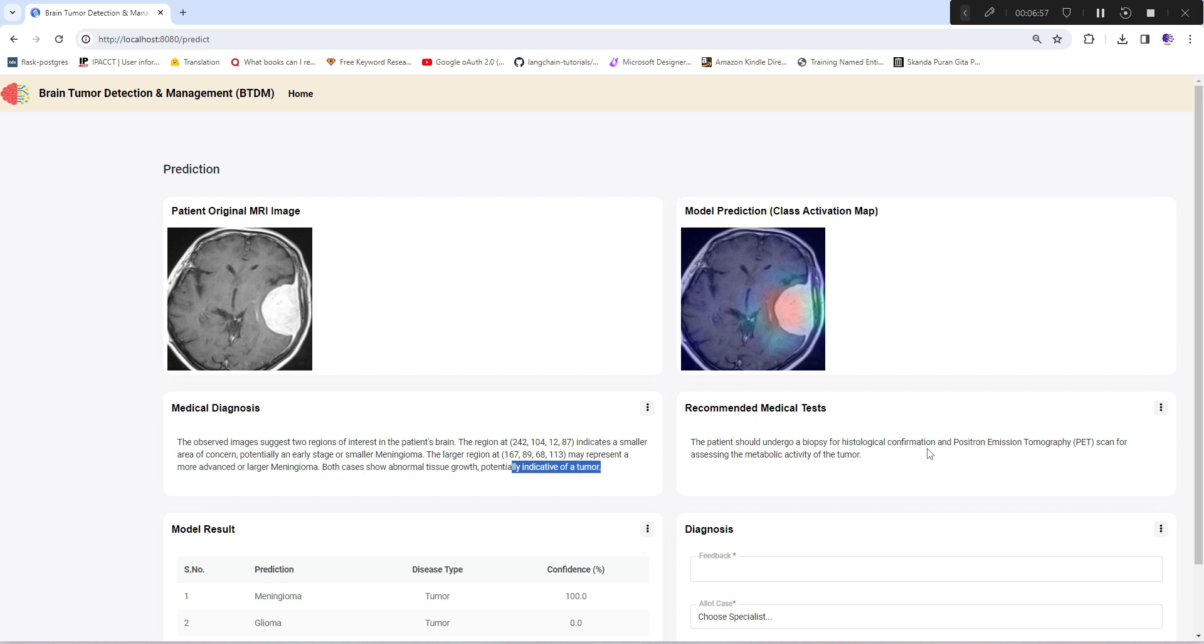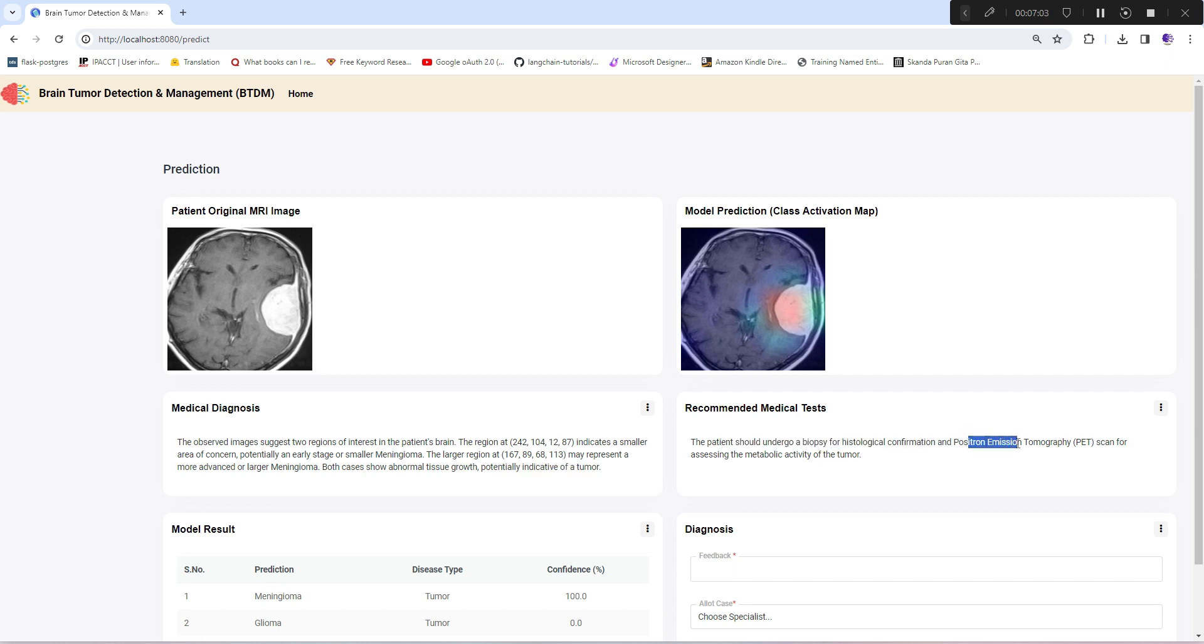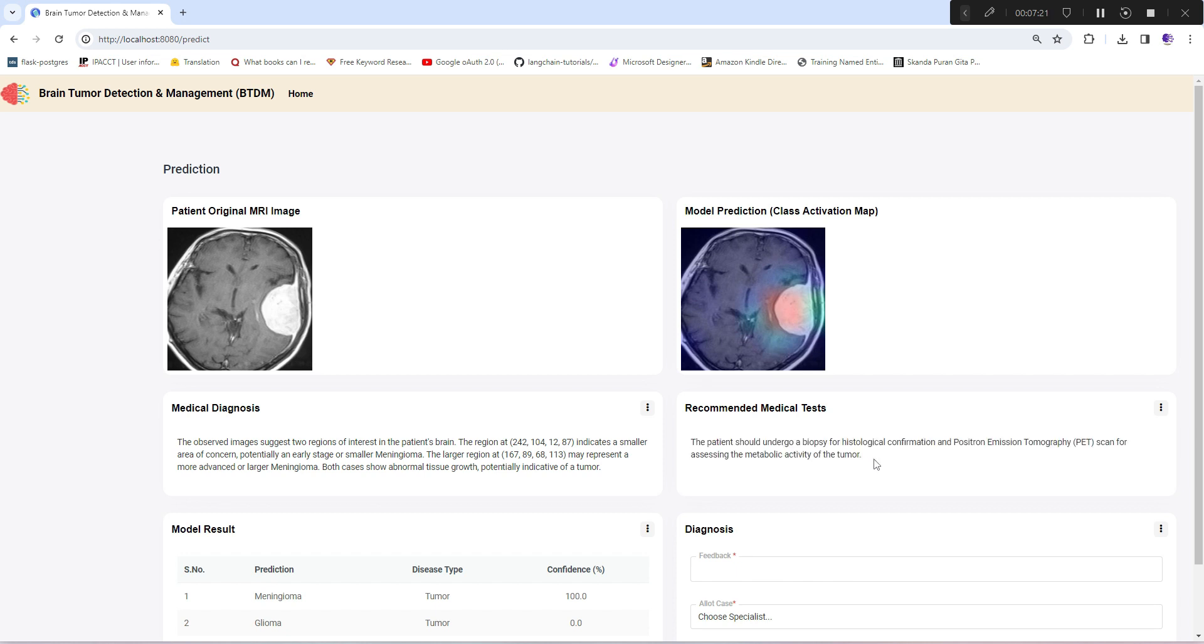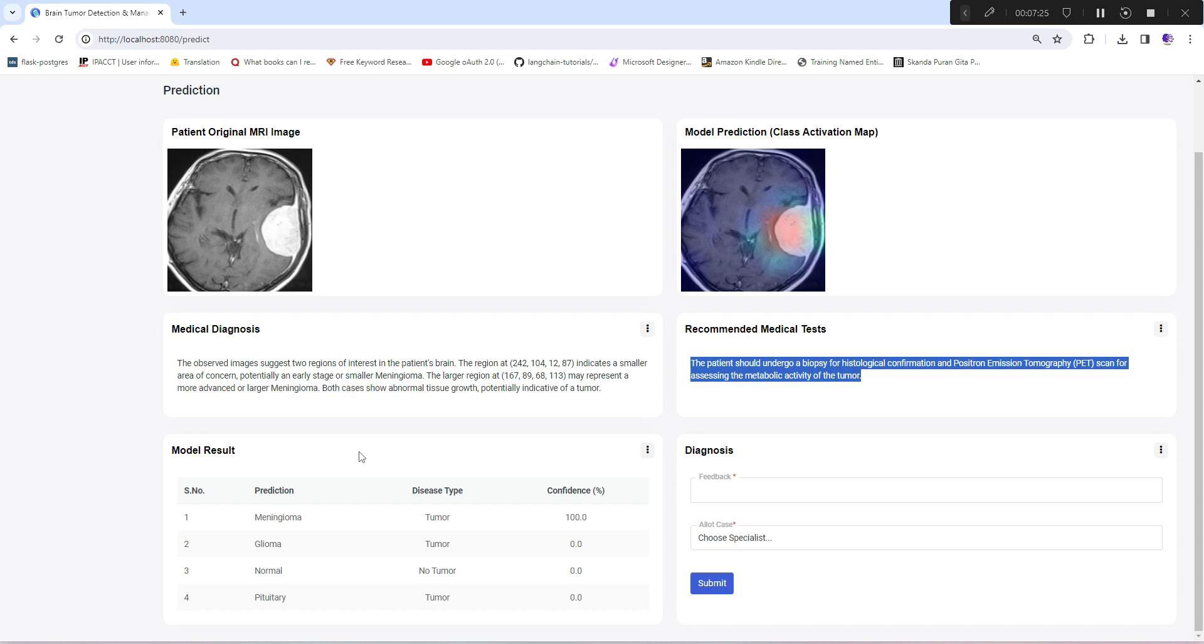For recommended tests, it's suggesting biopsy for histological confirmation and positron emission tomography (PET scan). This explanation is quite professional and standard on a medical scale - what usually medical or pathology labs suggest.